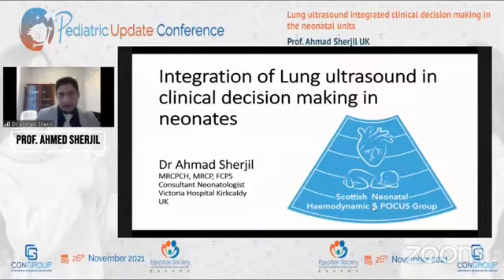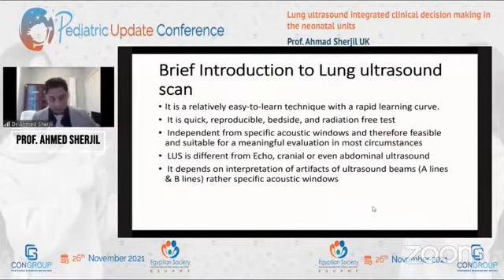It's always a good idea to remind ourselves how to score what zones and stuff. So it'll be a quick initial introduction, and then I'll move on to the actual presentation of taking you along in a ward round in a NICU.